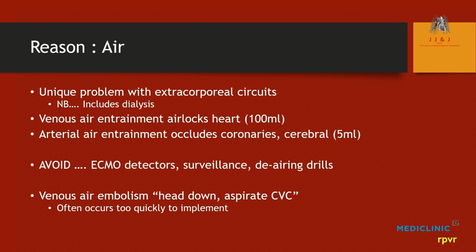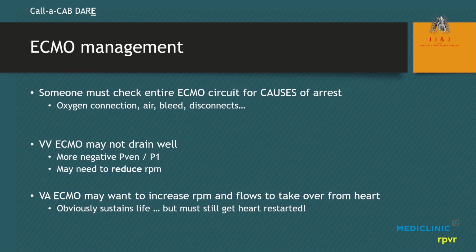Okay, last slide, I think. Yeah. Okay, sorry, not second last slide. You've also got a second patient. When the patient's had a cardiac arrest, somebody has to go back and look at the machine while everything is happening to the patient and check the entire circuit and all the possible causes.